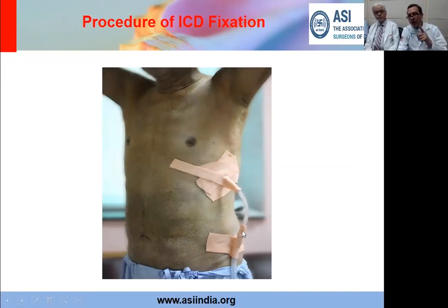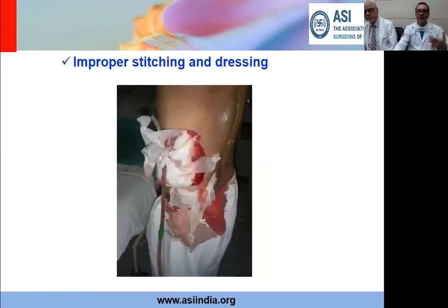And another important point, as you would see here, is that at the junction of the chest tube and the collecting bottle, we put a plaster, because numerous times we've had this issue of slipping of the tube and suddenly the chest tube is lying open. So it's important to secure this junction, and then you can secure this chest tube to the side. Now if there is any pull, suppose the patient is being shifted, moving, or doing exercises, the pull will be at this point and not at the insertion point, because a pull at the insertion point causes pain to the patient apart from the possibility of inadvertent pullout. Another small but I think important point.